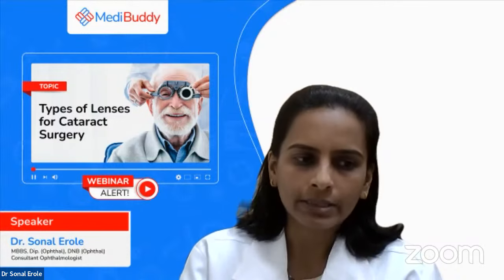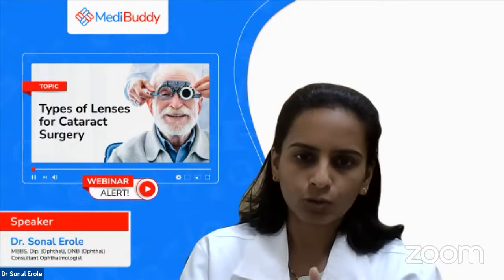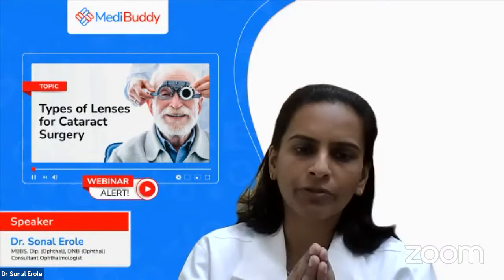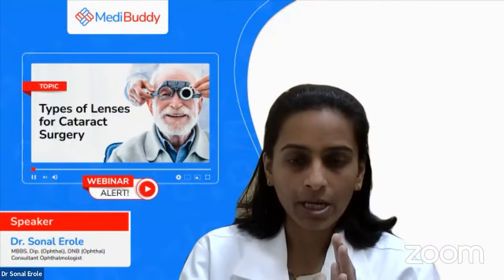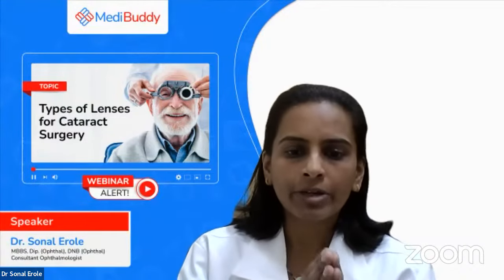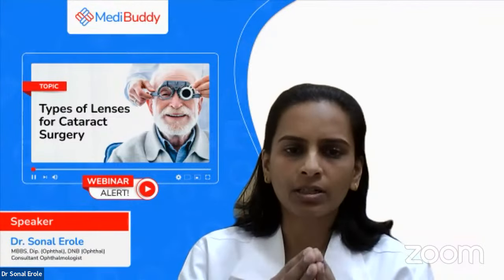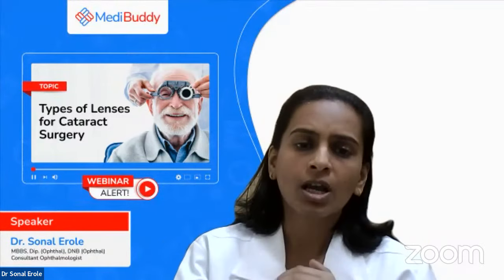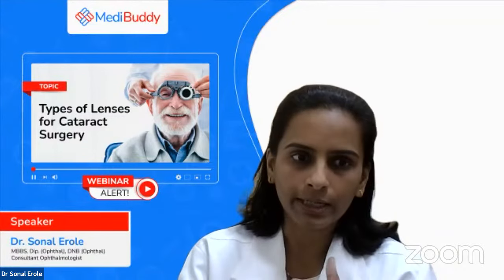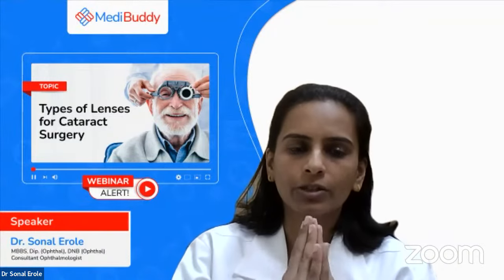So now the cataract is there. The patient knows that cataract is there, but what about after cataract? For the treatment of cataract, the only option available worldwide is cataract surgery. Nowadays, cataract surgery is available with all the advanced lenses. In the past, cataract surgery used to be a complicated procedure, with a big incision and sutures, and it used to be without IOLs. Then came the concept of the IOL, the intraocular lens. It means if we are removing a lens from the eye, we are replacing it with an artificial lens.